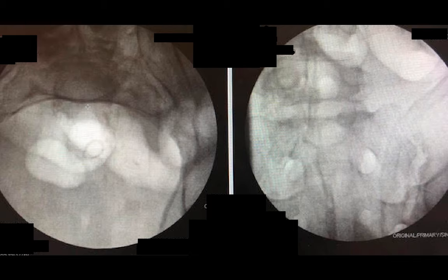So in this case, you have S1 overlapping S2 anteriorly, and you can see the dysmorphism of this pelvis, how your pathways are really going to be very narrow going into this S1 body. The field here is a little too small because the C-arm that I use is actually my partner's C-arm.